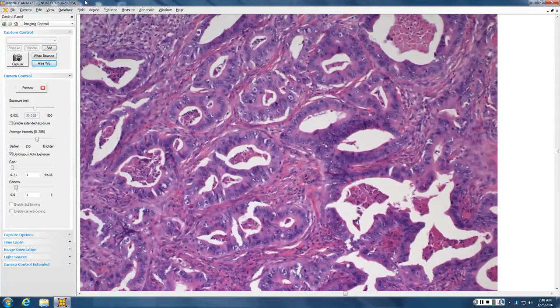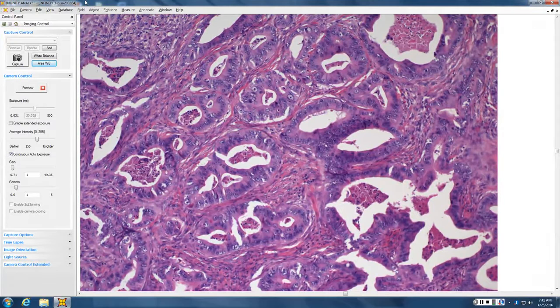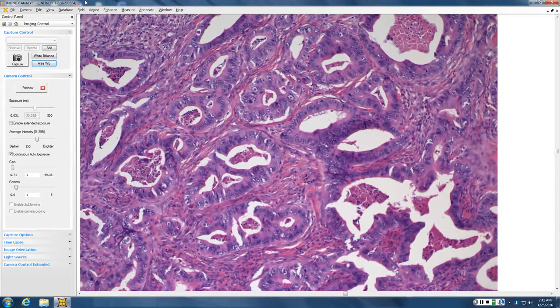Well, CK20. So keratin 20, what does keratin 20 tend to stain in terms of mets? Colon particularly. If you want to make it easy, 7 is a smaller number than 20. 7 tends to be anything with origin above the diaphragm. 20 is a bigger, heavier number, so it's everything below the diaphragm in general.